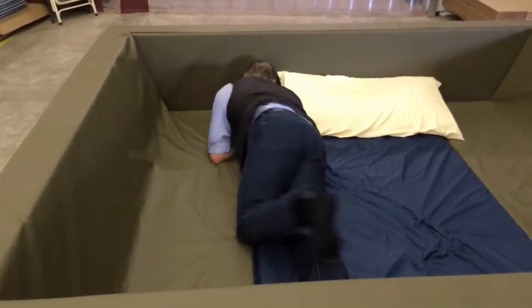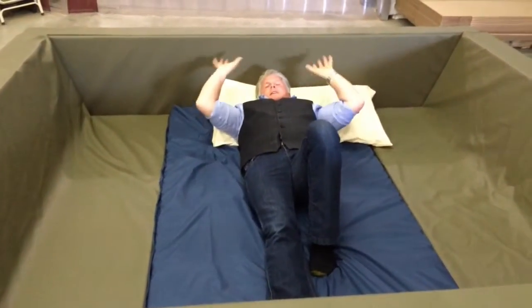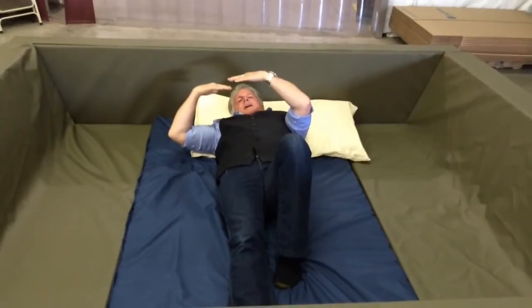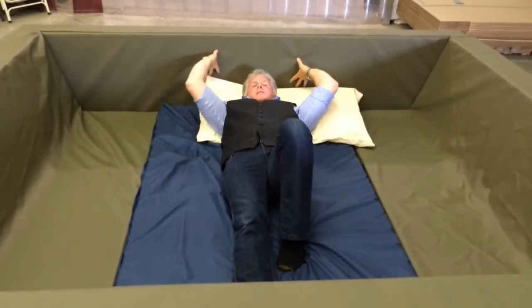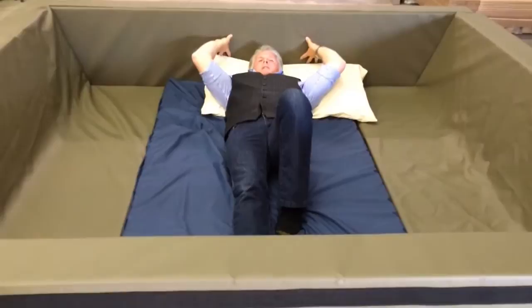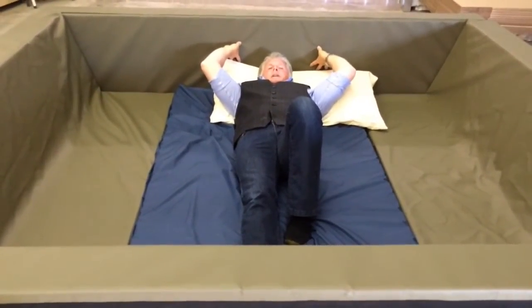Even in the headboard and footboards that we've built, instead of just using rigid foam, we've taken masonite boards and turned them on their sides and laminated them inside to create a truss system within the foam to give it more stability and structure so that it is less reactive to somebody pushing against it.